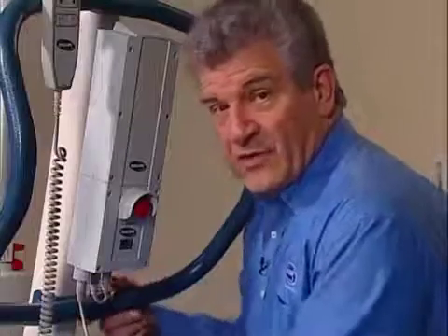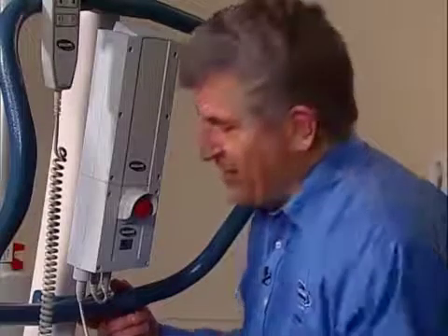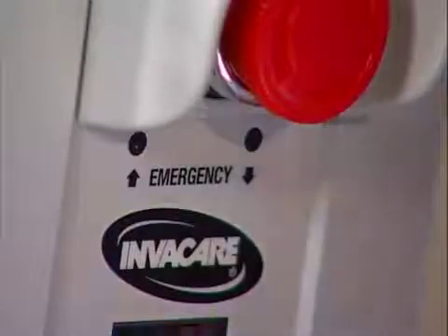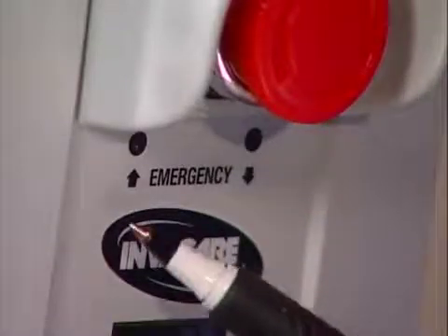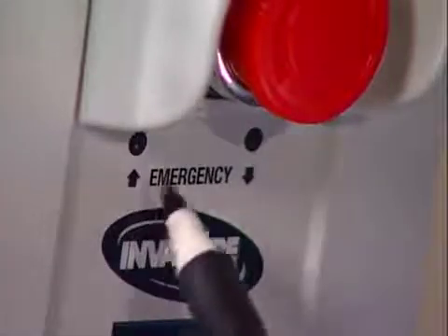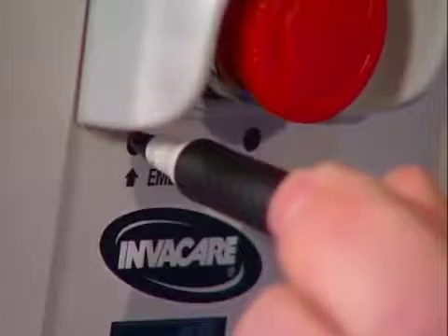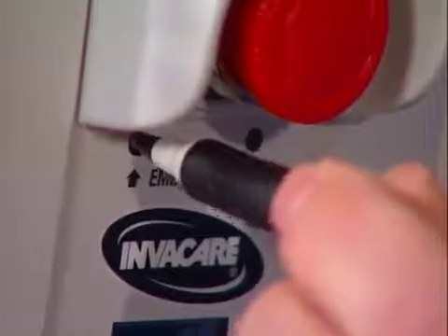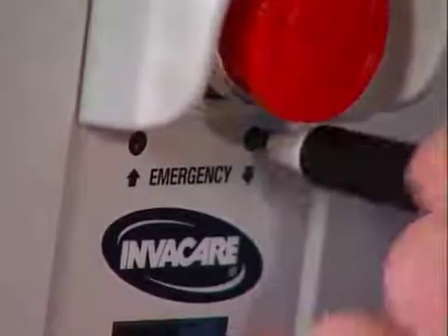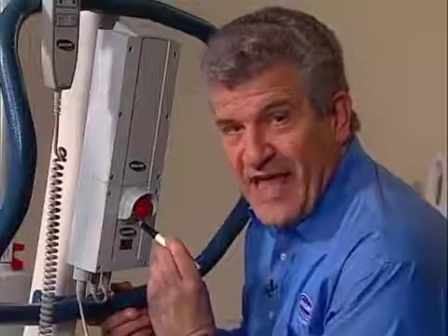The primary emergency releases on Jasmine lifts are more sophisticated. They're here on the control box. There's an emergency up and an emergency down release. Like the Reliant release, insert a pen or like object into the appropriate hole, up if you want to raise the lift, or down if you want to lower it. This will move the actuator independently of the hand pendant controls.